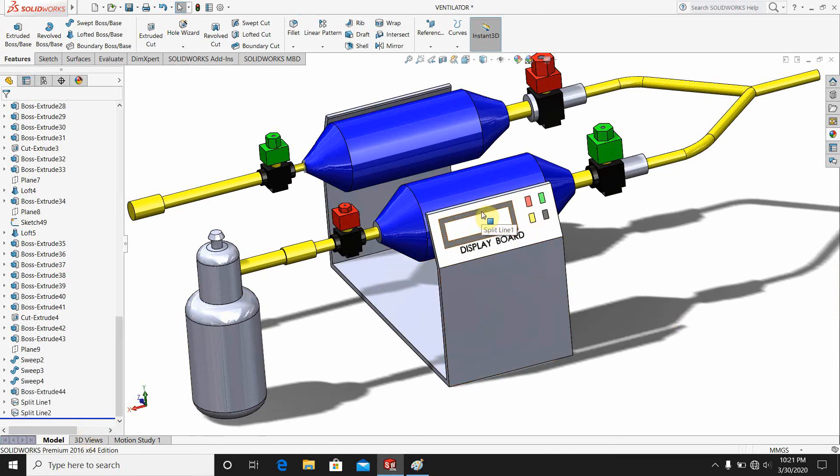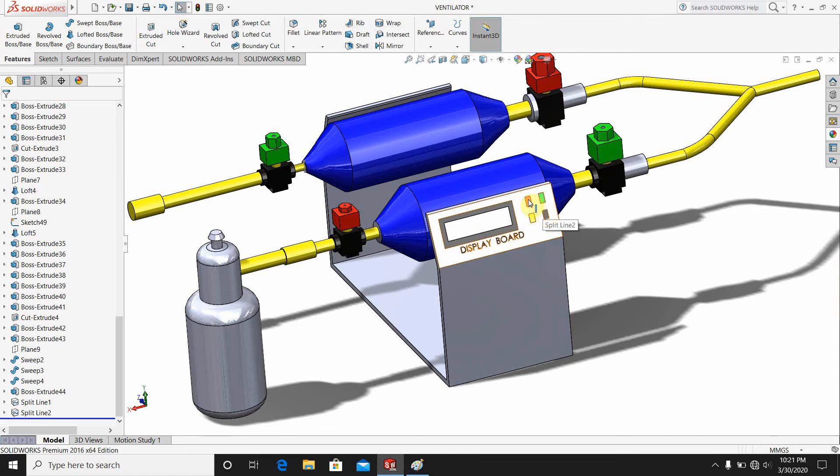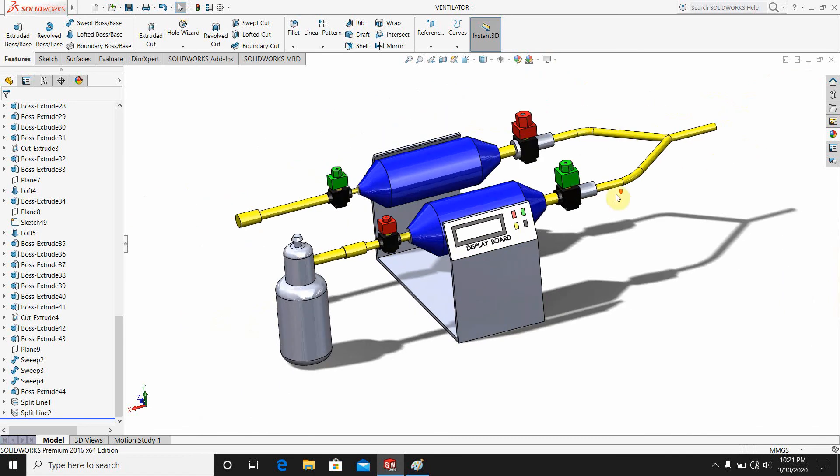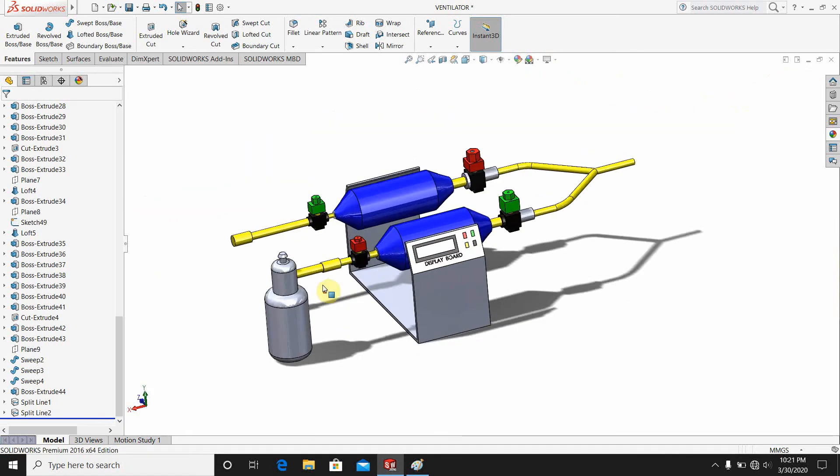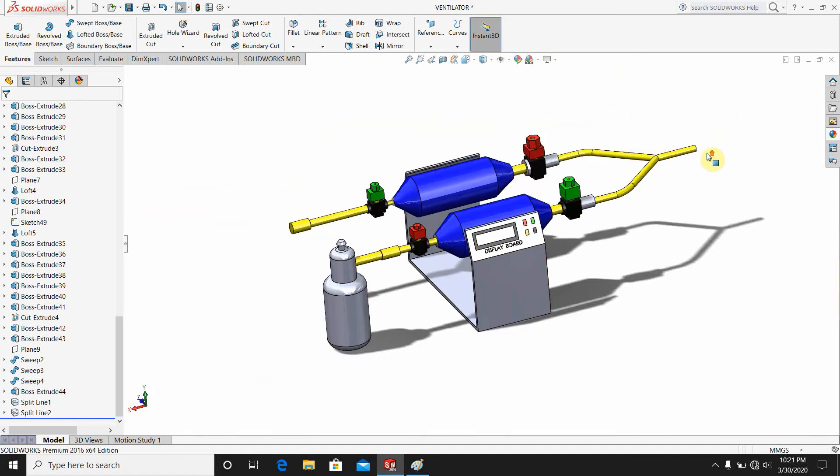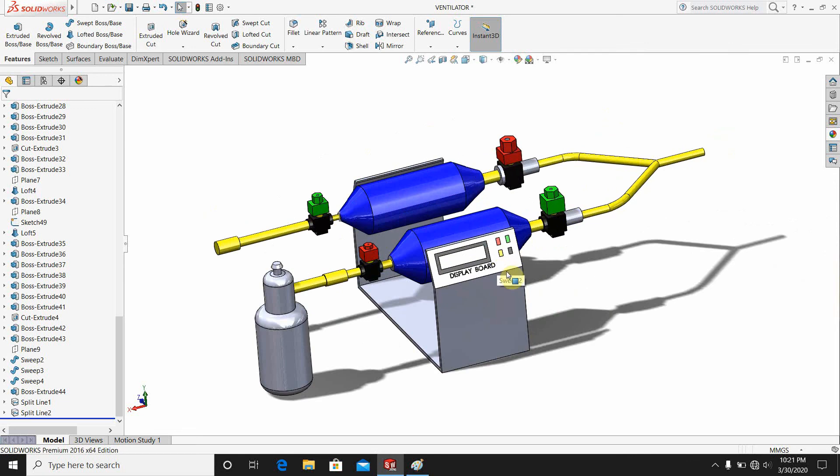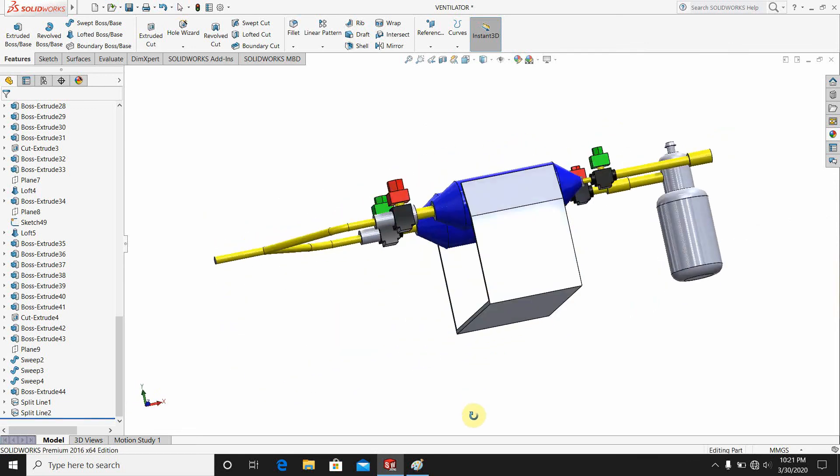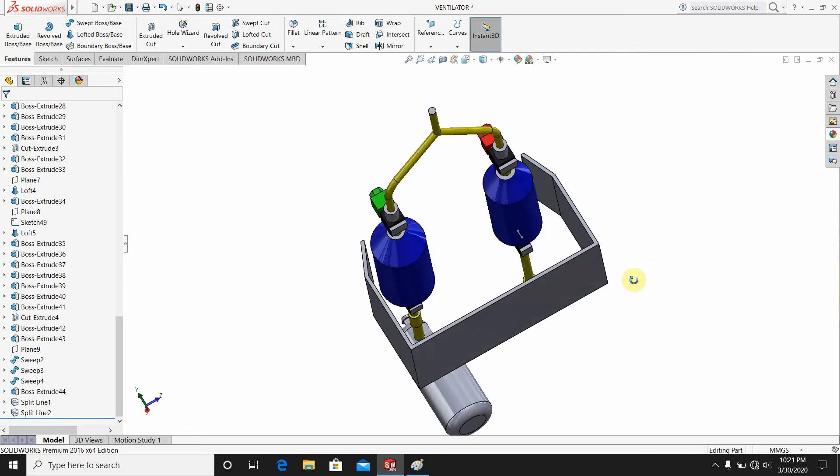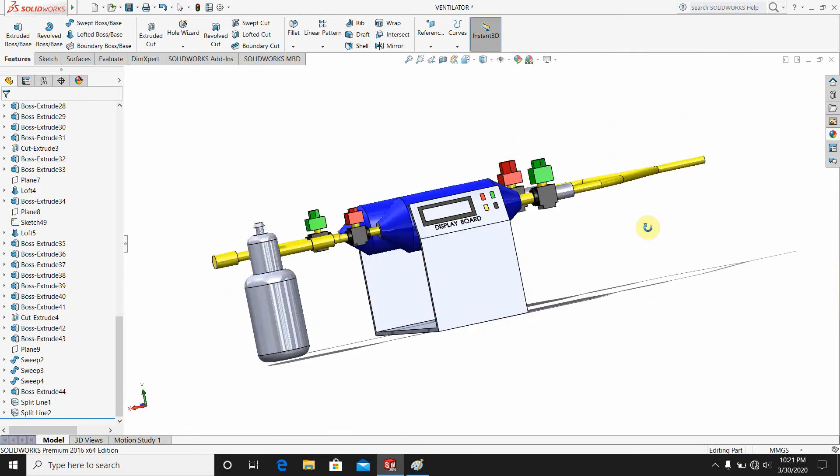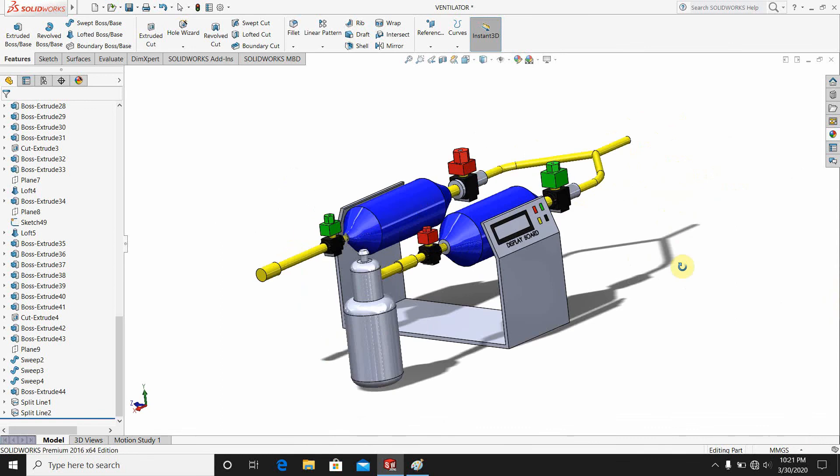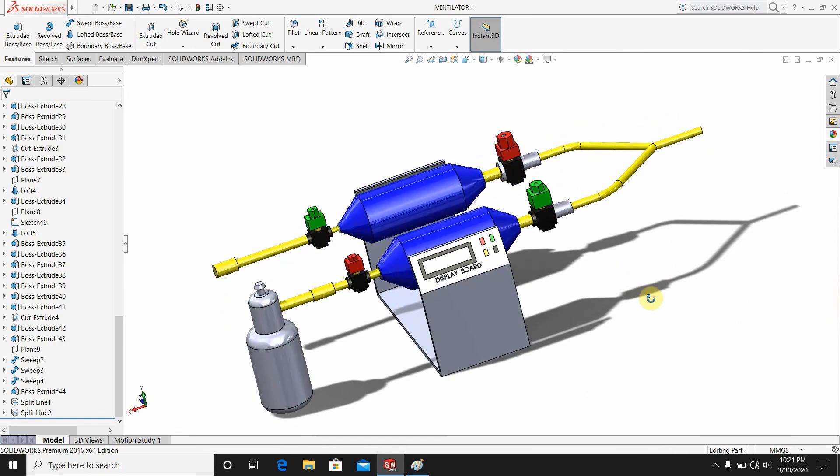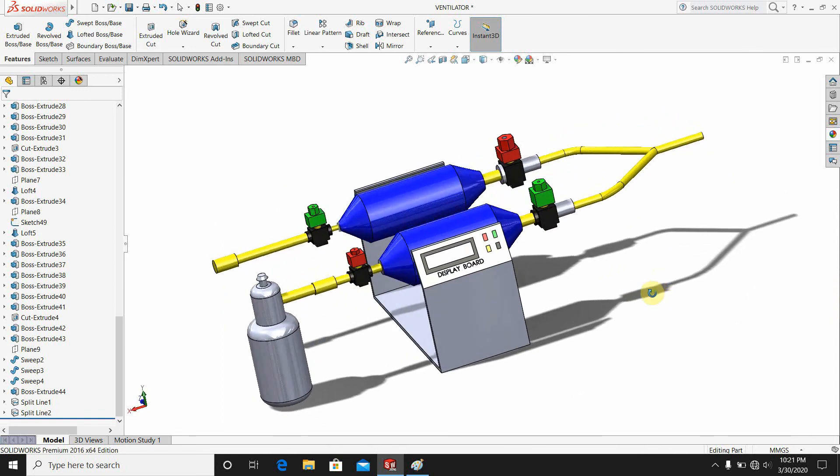This is the display I have done here. These are some of the buttons here, and this is the valve, this is the pipe system, this is the display board, and this is the cylinder. And this is the CAD model. If you see, there is the CAD model, and this is the design of a medical ventilator.